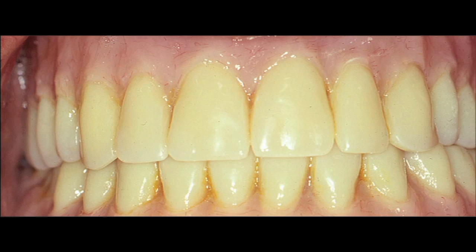Now, this denture followed traditional laboratory denture guidelines. Okay, you set the teeth over the ridge on the lower, you set the teeth over the ridge on the maxillary arch, and this is the ideal way for a denture setup. Now, when a patient has had a denture for a significant number of years, we have a loss of bone in the maxilla and a loss of bone in the mandible. And thinking about this, wow, and a significant loss of vertical dimension or supposed loss of vertical dimension, we have to get back to our starting point.